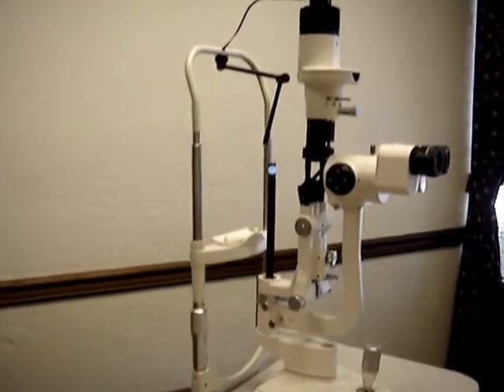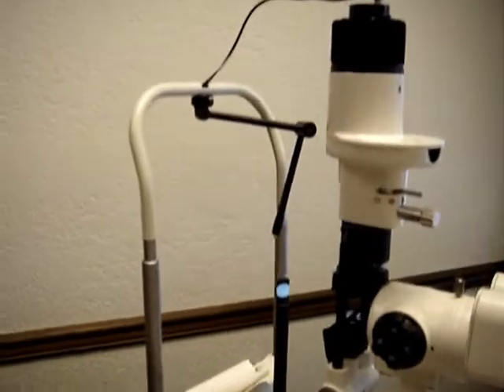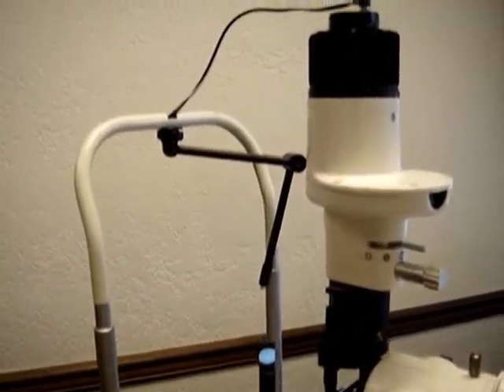This is the CMAX 800 series slit lamp. We will be demonstrating the simple procedure of changing the solid state LED light bulb.